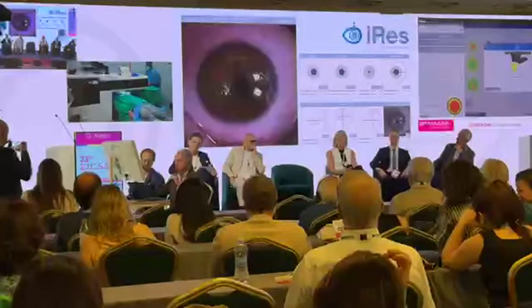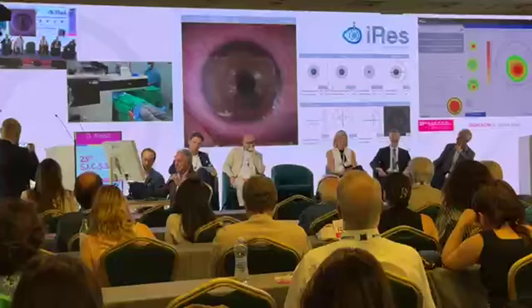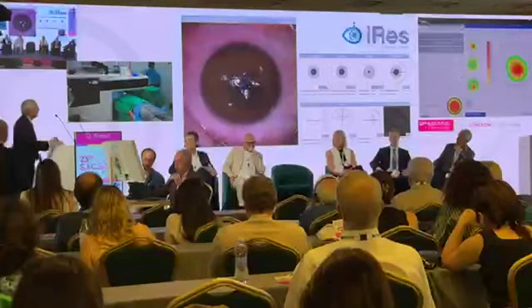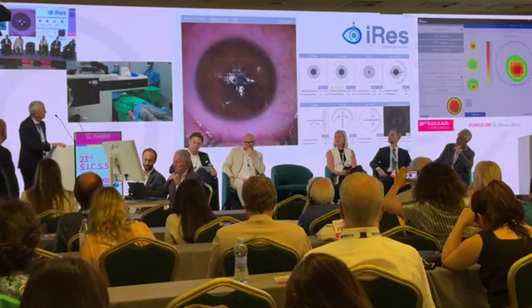Wait at the cornea, please. The system is making patient registration, bringing the pupil size to the same pupil size as on the tomographer, and then controlling the infrared light. As soon as this is completed, the surgery will start.